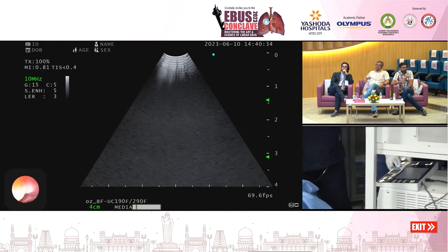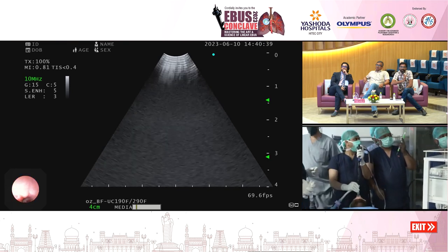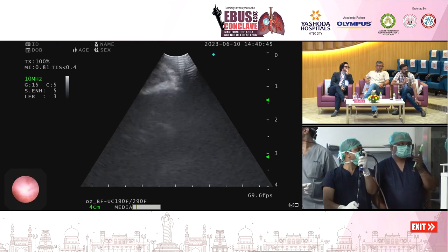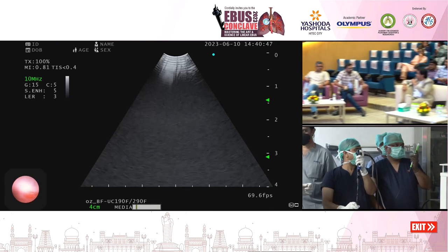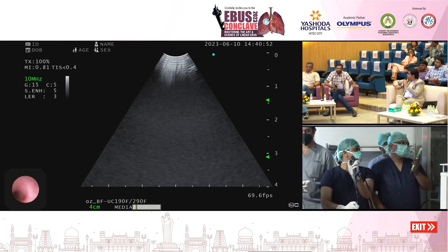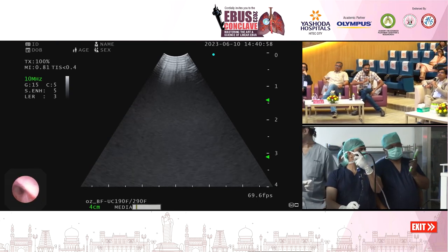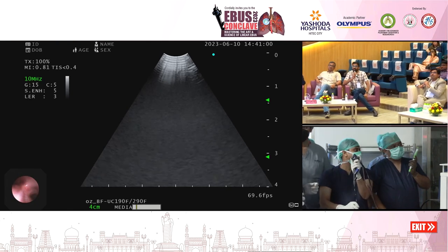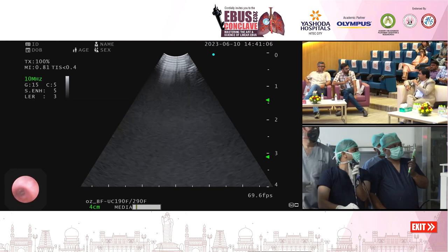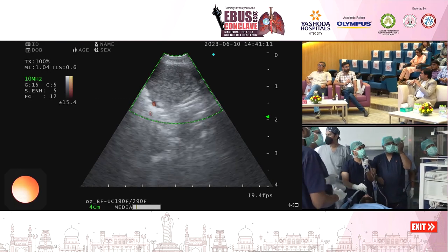What I wanted to ask was, with the different size of needle, do you check for the vascularity and do you prefer the less vascular nodes for the larger needle, or do you choose anything specifically, sir? In general, we would choose a less vascular node, but if there is no option, then I think we would still go about and do it. What is your experience with stations like 4R for such larger needles? The chances of bending are higher with the ProCore, at least we have had problems with the larger needles. Normally we don't use too much ProCore.